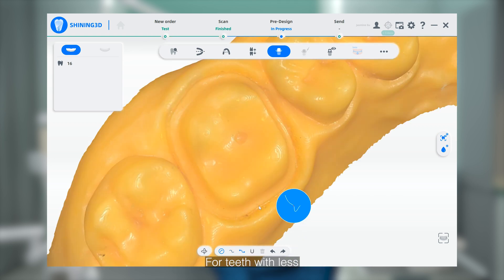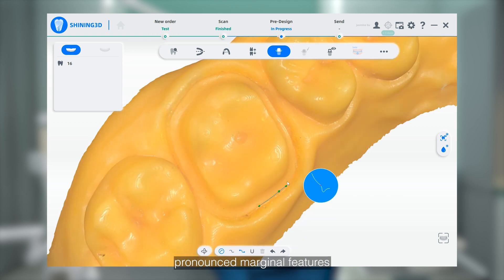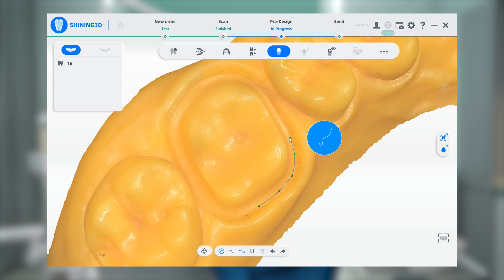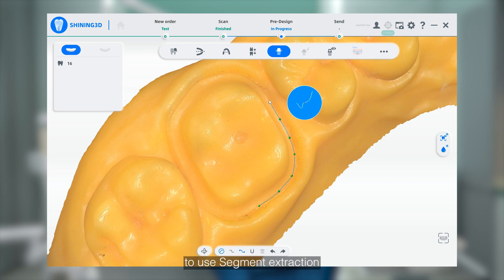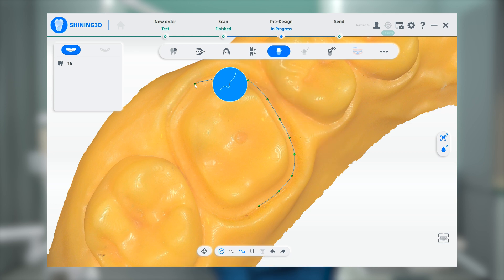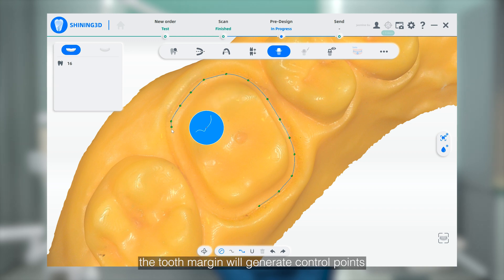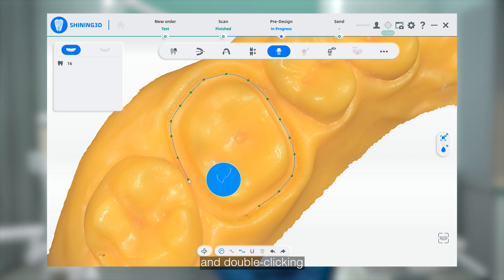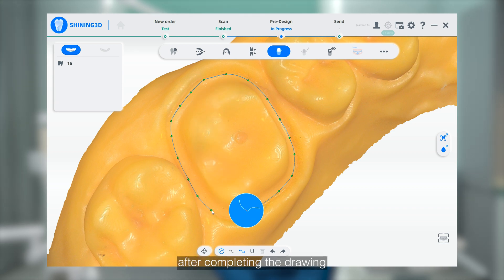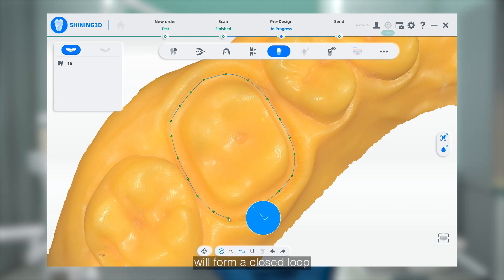For teeth with less pronounced Marginal features, you can choose to use segmented extrusion. Clicking around the tooth margin will generate control points, and double-clicking after completing the drawing will form a closed loop.